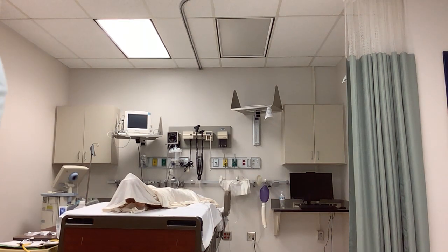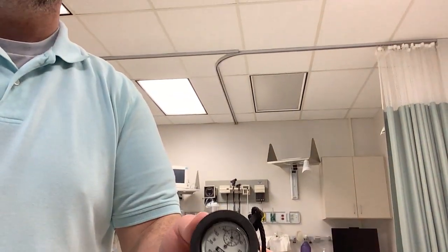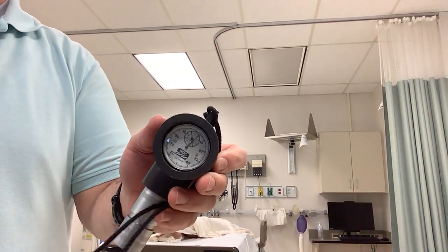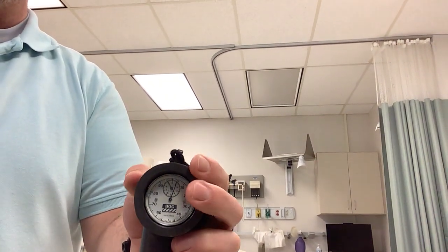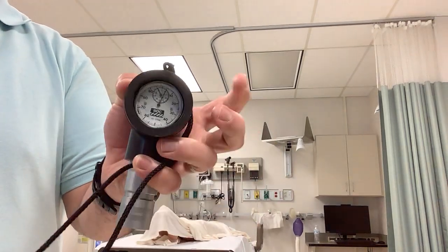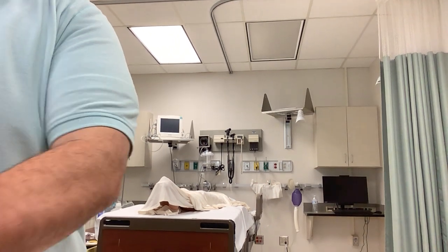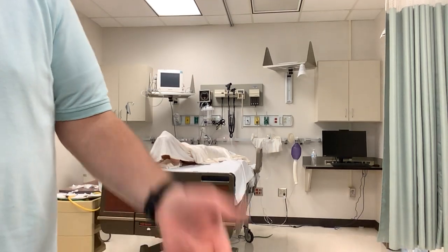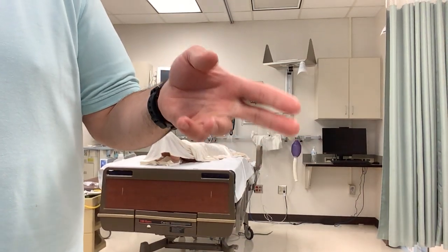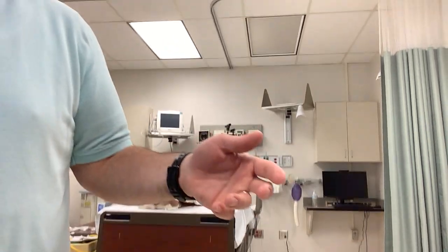Looking at the different devices, you can see this one is not a manometer, but a respirometer, and it is a little different in that your whole numbers are still going to be on the outside, but your decimal numbers would be in that smaller circle. So make sure that you can read your respirometer pretty well, because in the past, that's kind of been the more difficult aspect of those. You can do slow vital capacity, you can do a minute ventilation, a one breath tidal volume. We're going to have you do the minute ventilation and figure out what the tidal volume is.